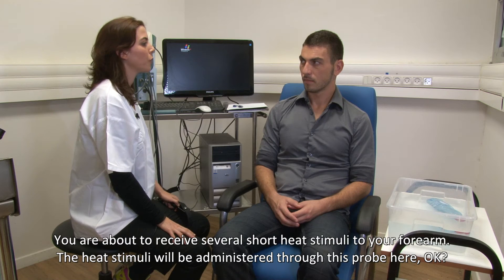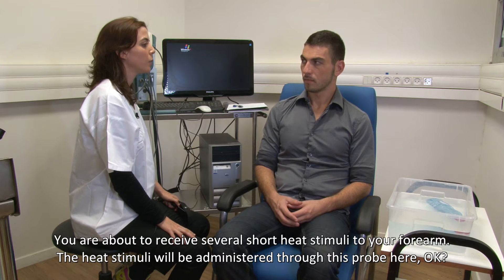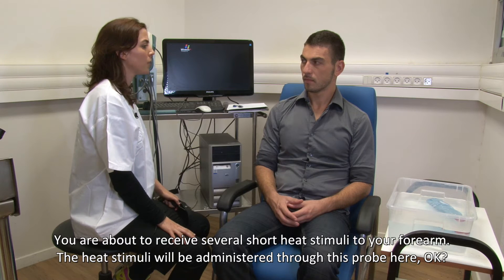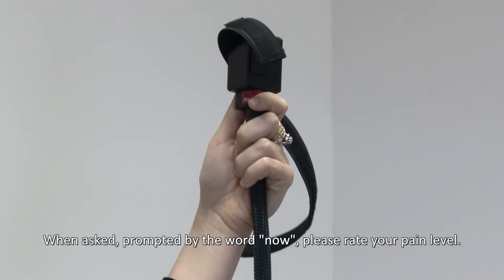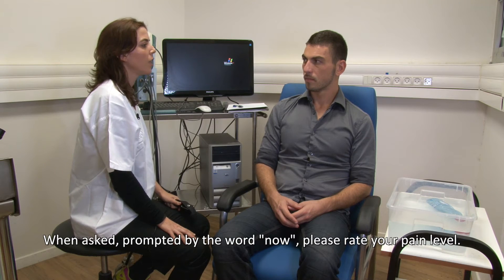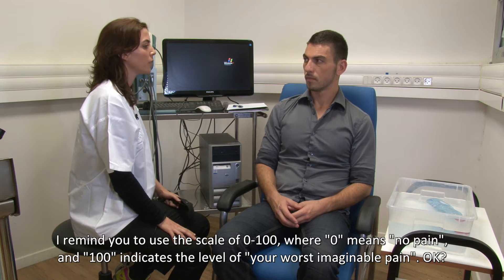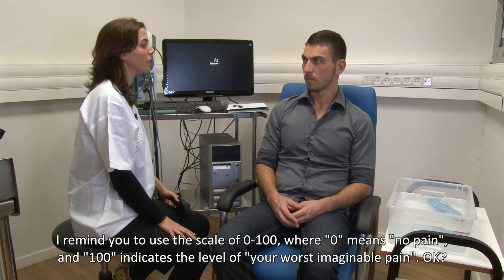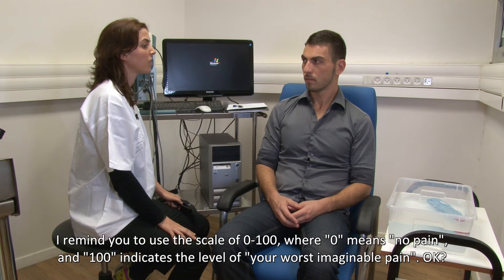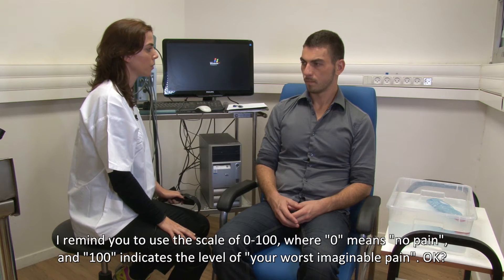You are about to receive several short heat stimuli to your forearm. The heat stimuli will be administered through this probe here. When prompted by the word "now," please rate your pain level. I remind you to use the scale of 0 to 100, where 0 means no pain and 100 indicates the level of your worst pain imaginable.